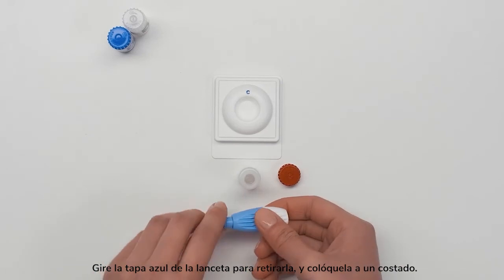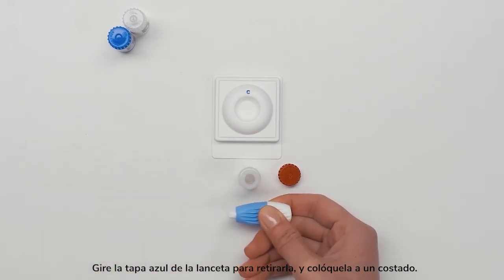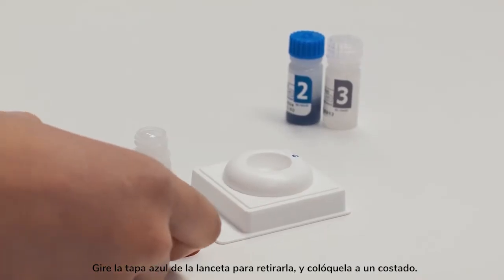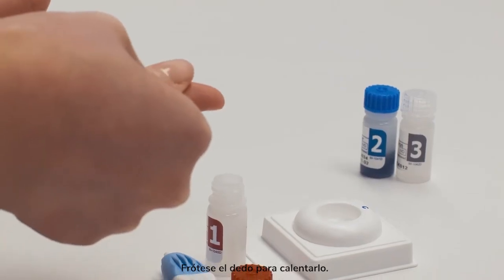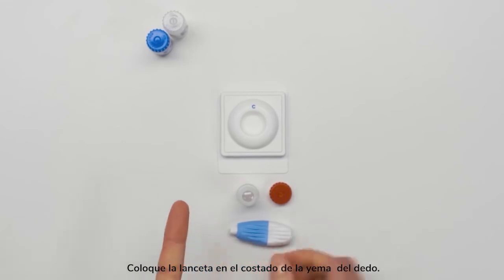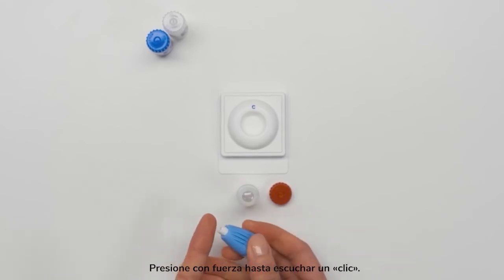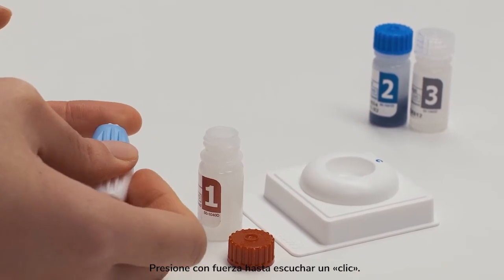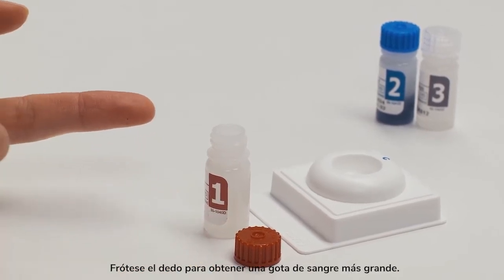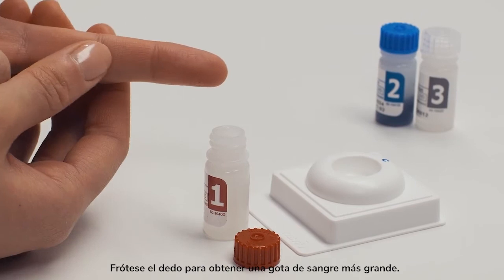Twist and pull the blue tip out of the lancet and place it aside. Rub your finger until warm. Place the lancet on the side of your fingertip and press hard until you hear a click. Rub the finger to get a larger, round drop of blood.